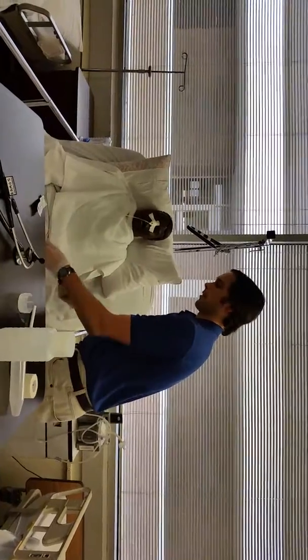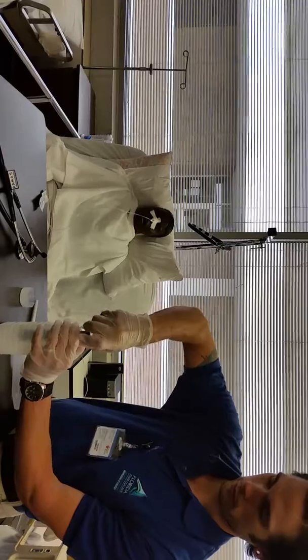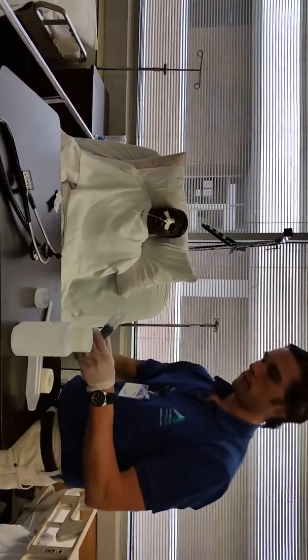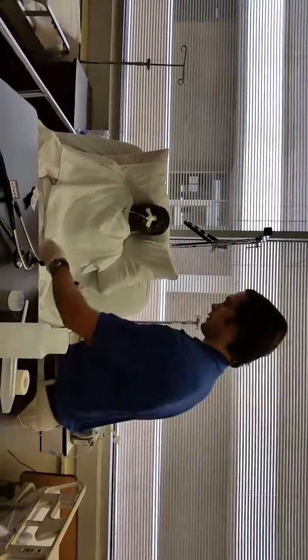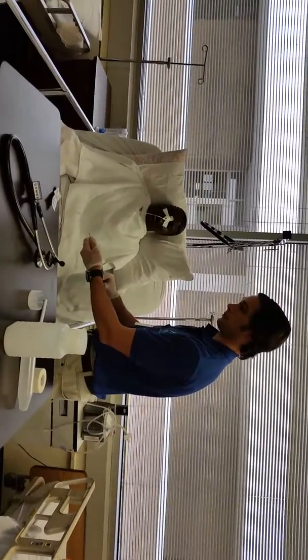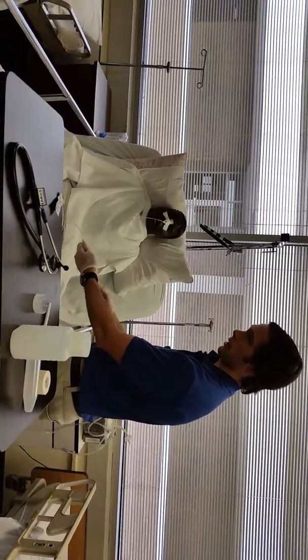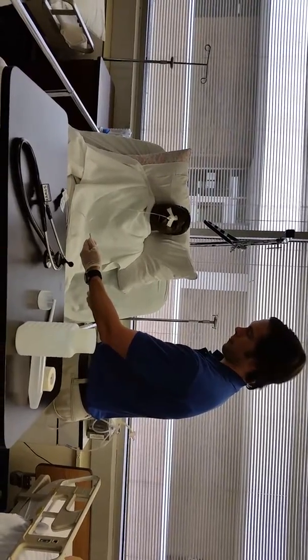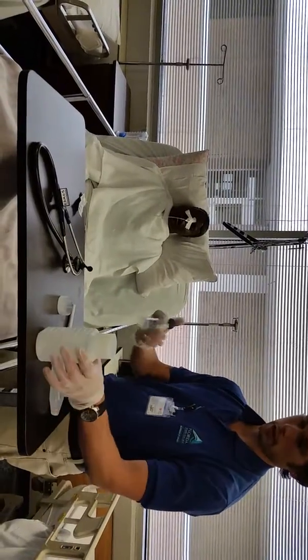Then for the irrigation, we're going to draw up 30 ml of water. I got my bucket here of faucet water. We're at 30. That's the 30 ml of normal saline or regular water. And then withdraw whatever I can get out. Measure it, and then discard it into another container.